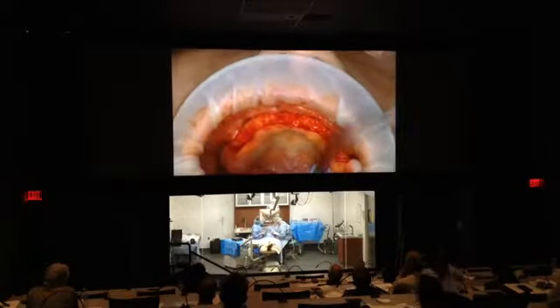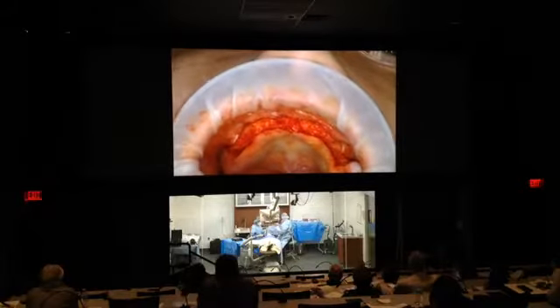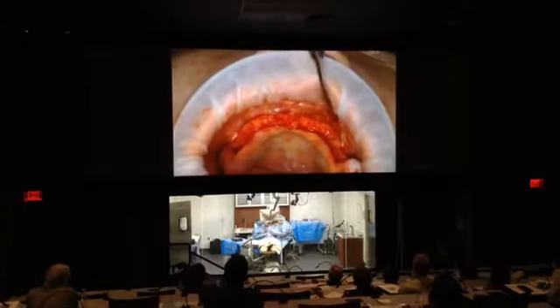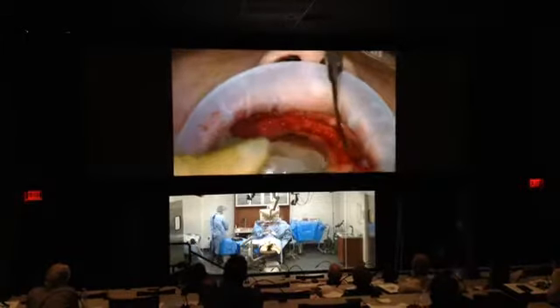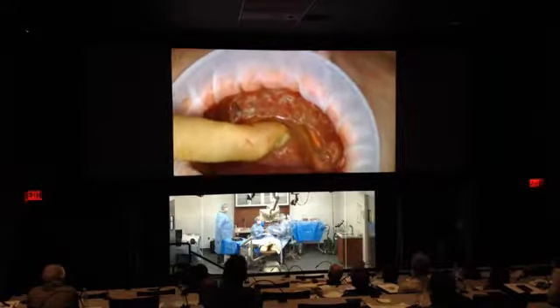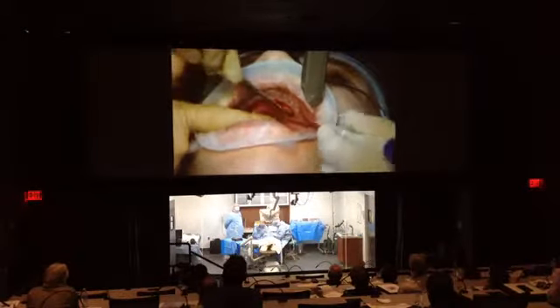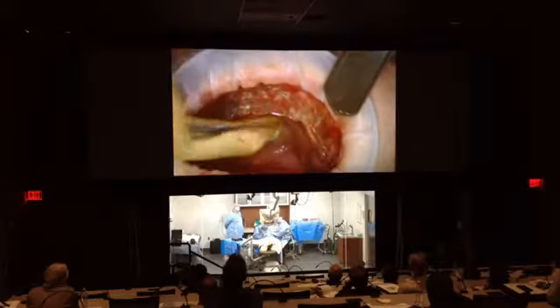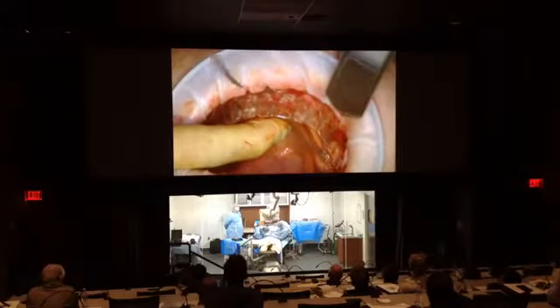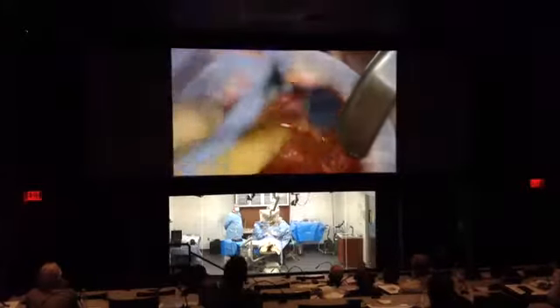Okay, so let's try the surgical guide and see what we have. At this point, what I'm checking for is to see where the bone is in relation to the surgical guide. You actually have a good view there. The bone is exactly where the ridge is, a little bit atrophied in the front. So probably we will end up with straight abutments there. But one way to check for sure, to make sure that the guide is in place.